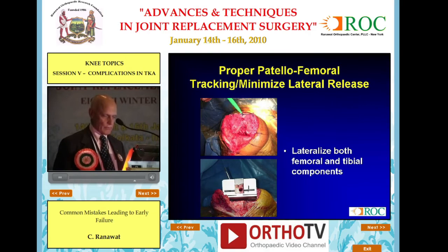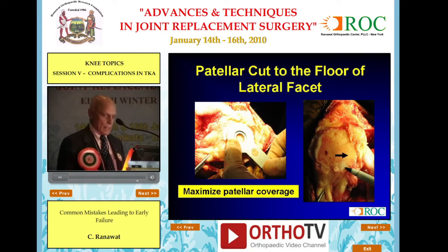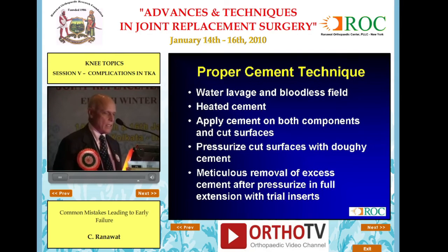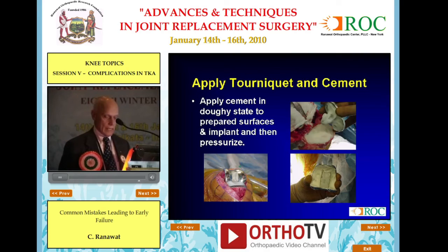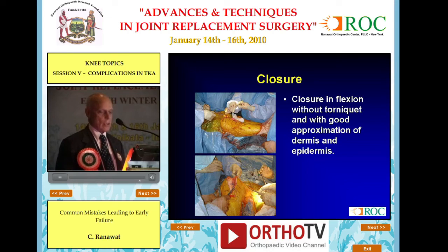Flexion gap parallel to the femur, and here is how to lateralize. This cortex, that cortex, and half of it. That's how you lateralize. When you lateralize properly, the lateral condyle is a little narrower than the medial side, because that's where the bones are. Patella, I'll talk more, so I'll skip this. Check the stability in flexion, proper cement technique, and here I'll say I heat the cement so it sets within 7-8 minutes. Apply on both sides and pressurize it. And closure: close the dermis well, otherwise you'll get an ugly scar.